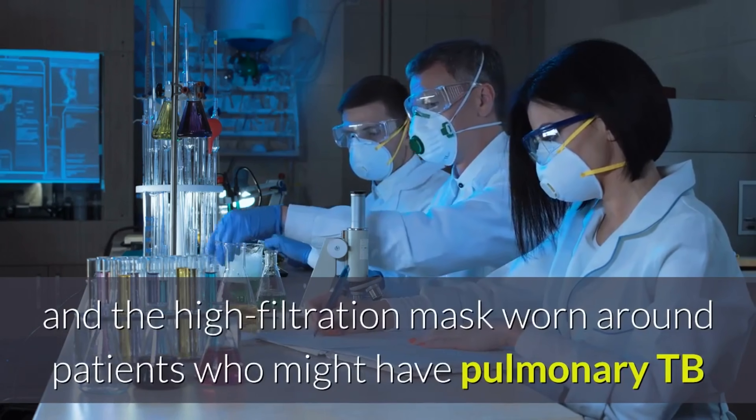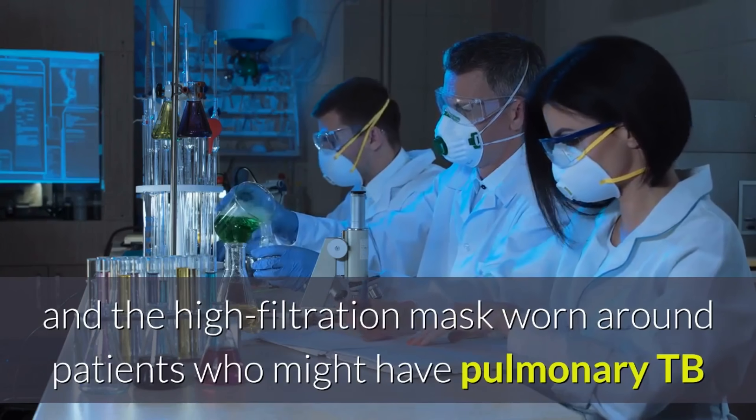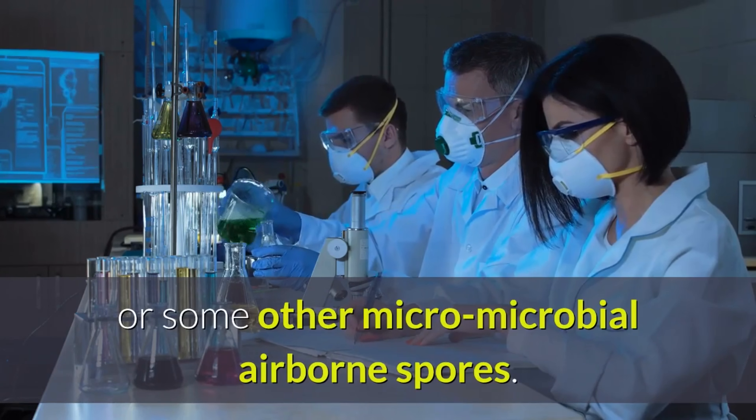Cone masks are pre-pressed filtration cones with a liquid-resistant layer on the outside. The high-filtration mask is worn around patients who might have pulmonary TB or some other microbial airborne spores.